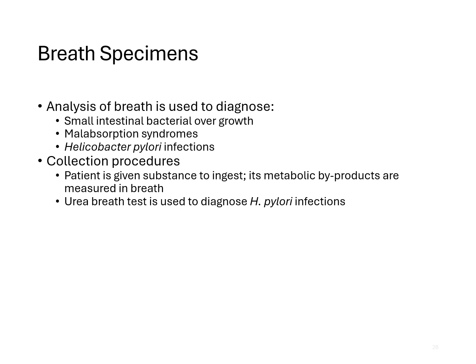The patient is given a urea capsule to ingest. The patient must prepare for the test by observing the following. They would have no antibiotics for 4 weeks. None of the following medications for 2 weeks before the test, such as Prilosec, Prevacid, or Pepto-Bismol. Nothing to drink, including water, for 4 hours before the test either, as they can all skew results.